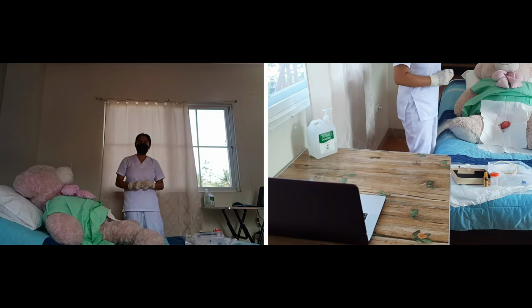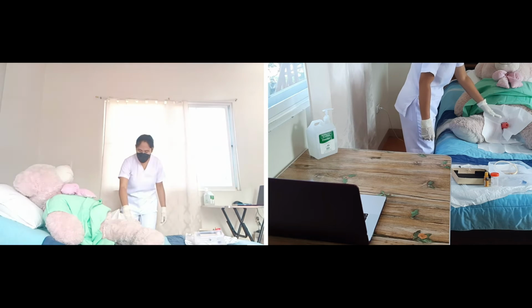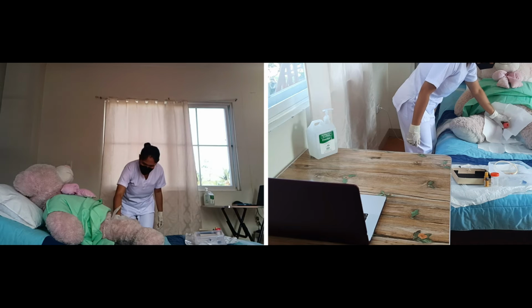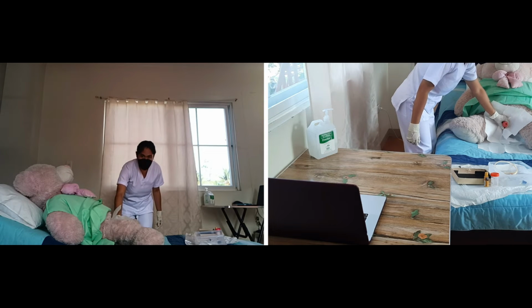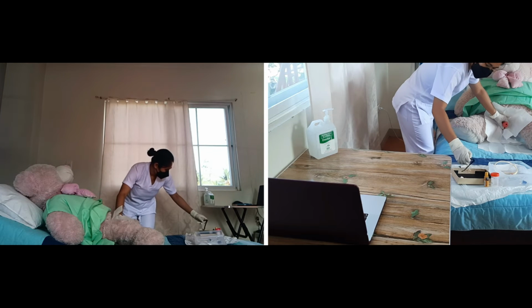Okay, we're set. So with my non-dominant hand, I'm going to slowly grasp the shaft of the penis, just below the glans, and hold this position throughout the procedure. So now I'm going to clean the meatus, which is also done 3 times with the use of antiseptic solutions.